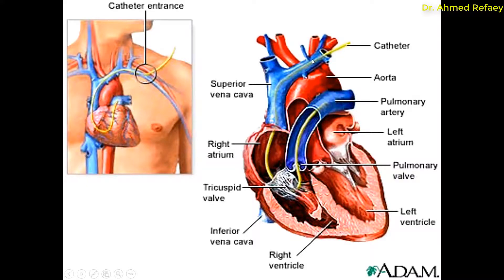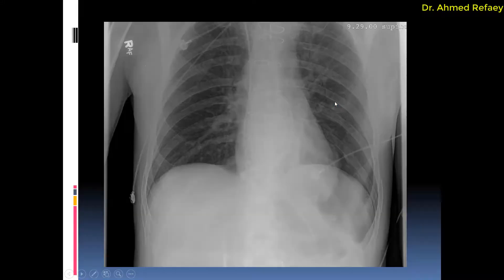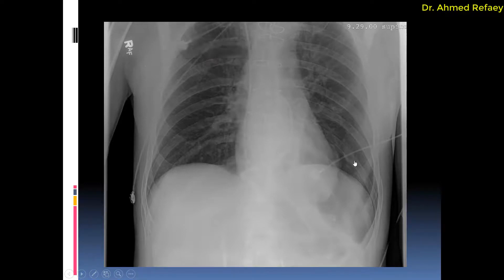Another example of a Swan-Ganz catheter inserted through the left brachiocephalic vein to the superior vena cava, right atrium, right ventricle, and pulmonary trunk, with its tip located in the pulmonary artery — either right or left. This is an example of correct placement, as you see: going to the superior vena cava, right atrium, right ventricle, pulmonary trunk, with the tip located proximally in the region of the right pulmonary artery.